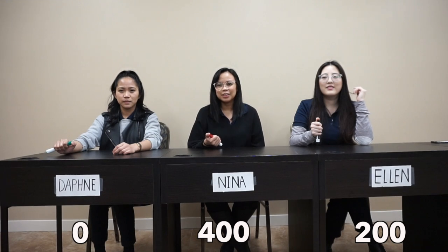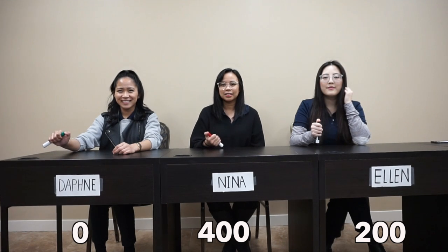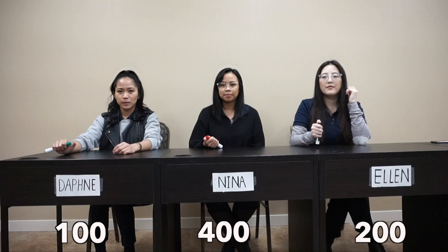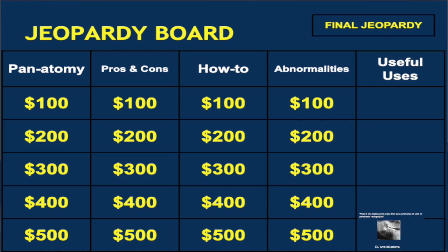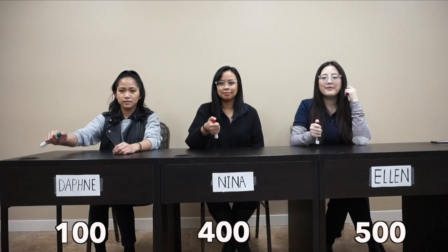Pick the next question. Useful uses for 100. Viewing these certain teeth that can't erupt into the mouth. Daphne. Impacted teeth? Yes. Useful uses for 300. Abnormalities and disorders in this hinge and slide joint. Ellen. What is TMJ disorders? Temporomandibular joint disorders. That's right. Useful uses for 500. What is this radiolucent lesion that can be commonly seen in panoramic radiographs? Daphne. What is bone loss?